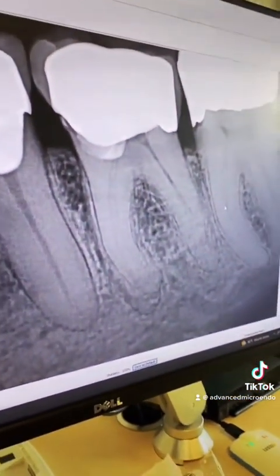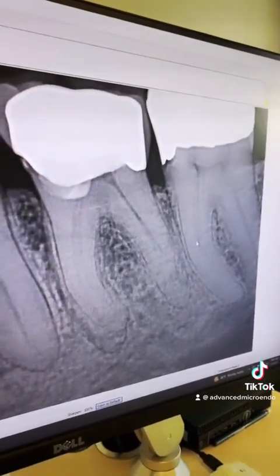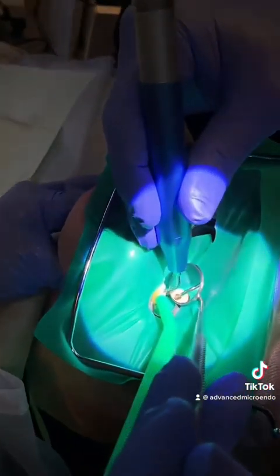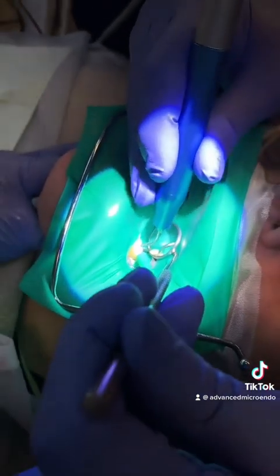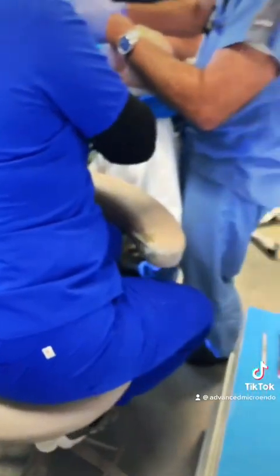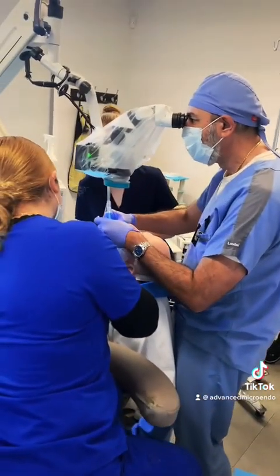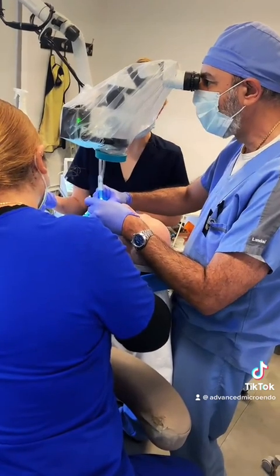Tooth number 19. So this is how we're doing this root canal, because this patient cannot be in a full supine position because of his breathing. So now we have to do this, stand up. But I can still use the microscope, and I'm using my ultrasonic right now. But sometimes you have to be flexible.